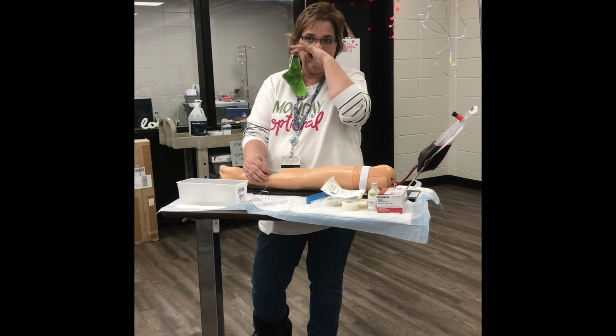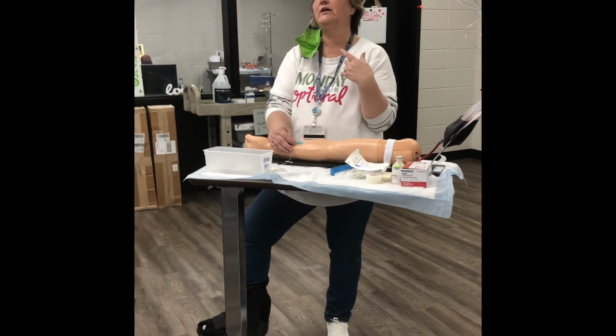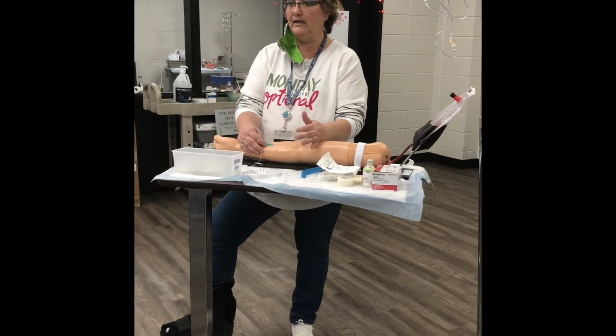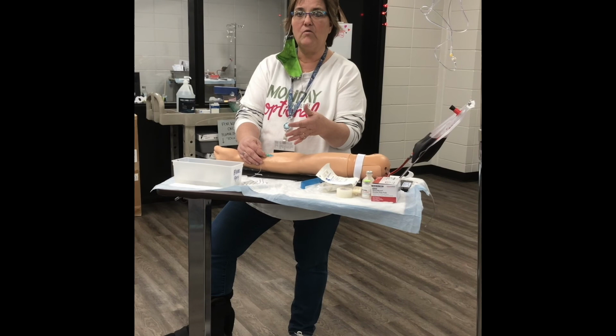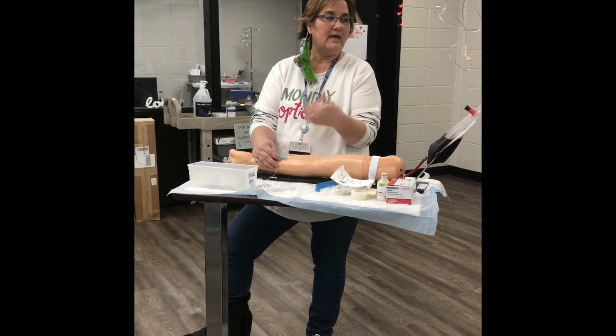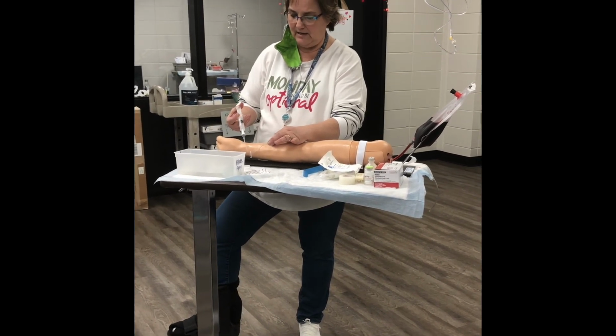It's just saline, it's just into the vein, so it may sting right at the beginning, but it shouldn't really hurt. And there should be no swelling at the end. If there is, then you're not in the vein anymore. You've either blown out the back or whatever. You would take it out and re-stick. But, so I'm going to flush, and I'm good.